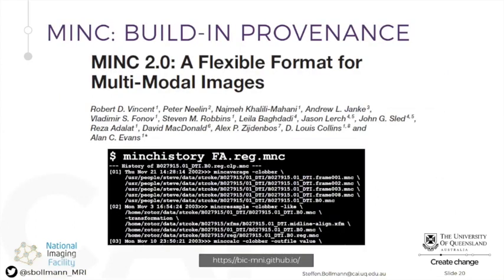And if you want to do this, there is one format that can do it already built in, which is MINC. MINC is like Nifti. It's a file format for neuroimaging data. When you run a processing on this file, it will always keep a history of what happened to this file, so you always know what changed your data. The problem is MINC is not so widely used anymore, and not every tool supports it. So most people still use Nifti.